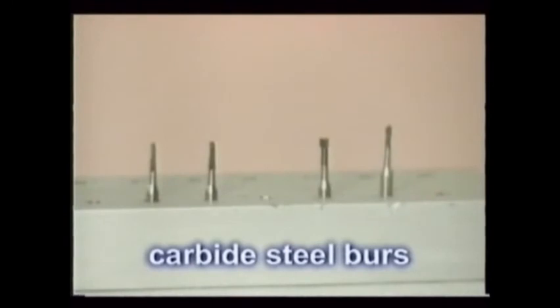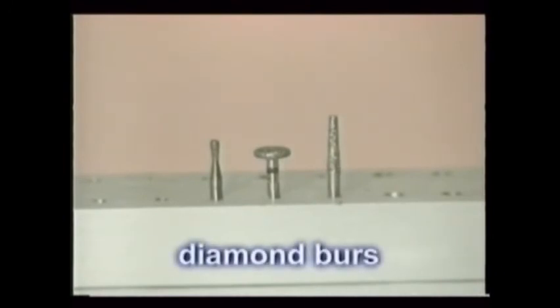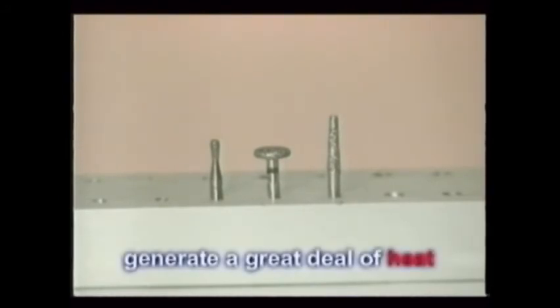Burrs that are used in directly placed restorations, amalgams, and composites are usually made of carbide metal or steel. They'll be silver-colored. Diamond rotary instruments, also called burrs, have diamond chips impregnated in their cutting ends. These are extremely efficient, but also generate a great deal of heat. They are most effective in removing rapidly a lot of tooth structure, especially during indirect restorative dentistry like the fabrication of crowns.